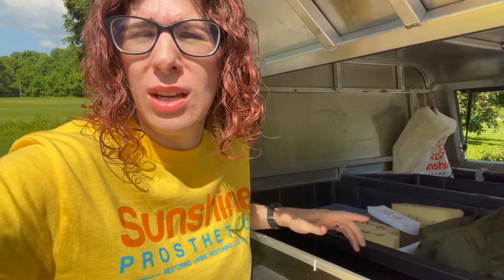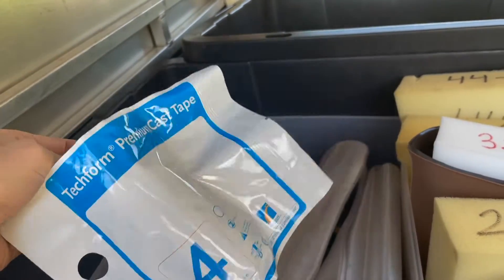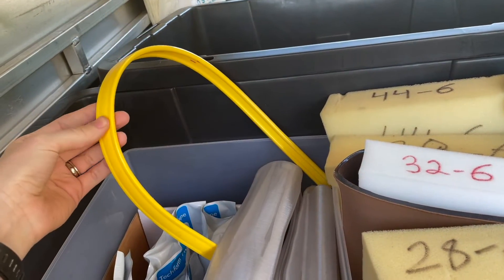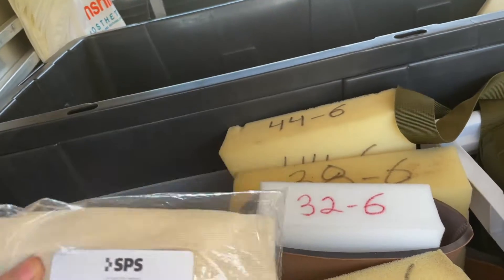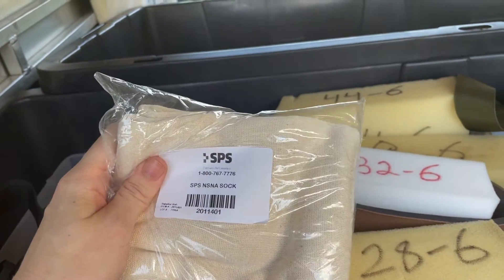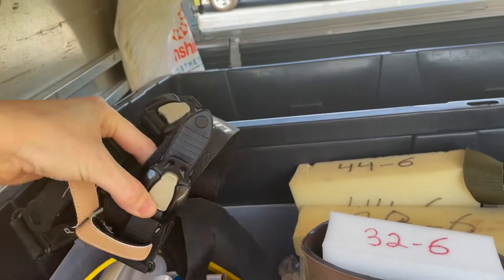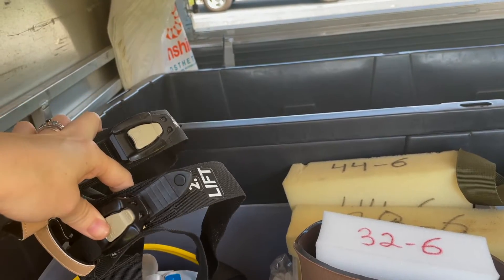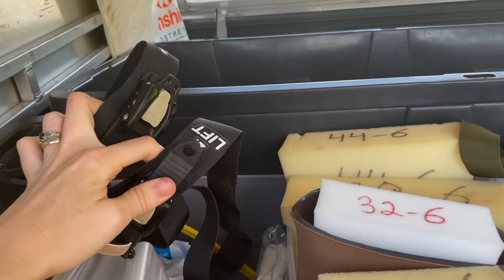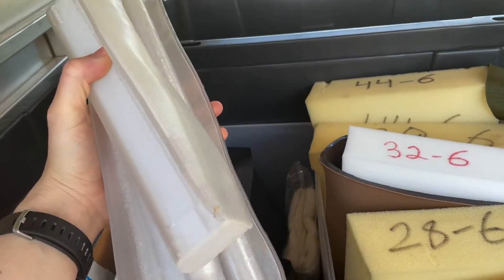Starting with this first bin — this is all my casting supplies. When I'm going in to evaluate a patient or I know I'm going to be casting, this is where I start and get everything I need in one place. This is my casting bag with all the supplies, casting tape to take the impression, cut strip for ankle foot orthoses. For prosthetists out there, these are awesome — relatively inexpensive and great for transfemoral casts. They're basically like pre-made stockinette shorts. I'll do a separate video on our transfem casting technique, but just as a teaser, we got a set of ratchet straps — basically like a tourniquet — that we use to hold three cast pieces into place on the patient's limb.